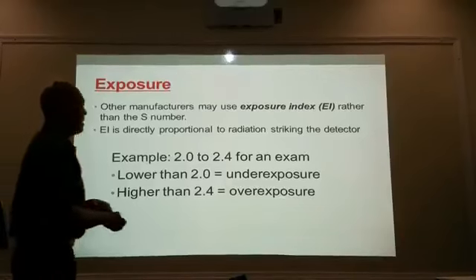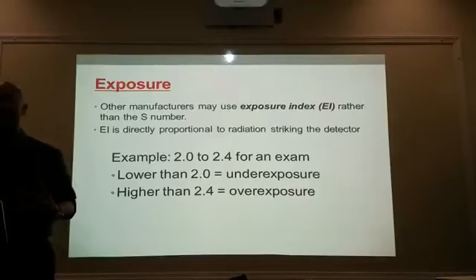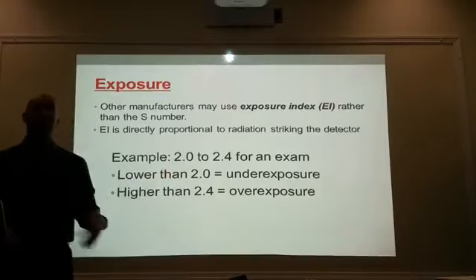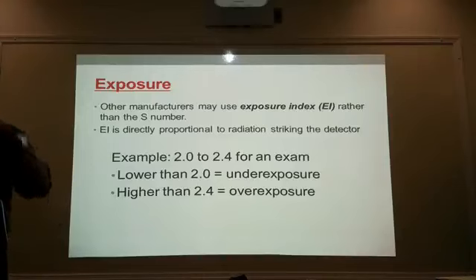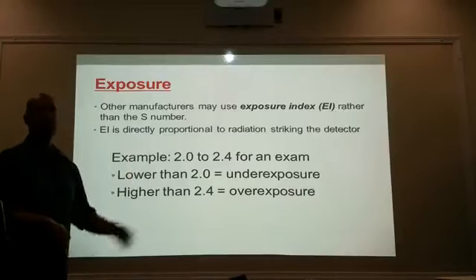Now, not only are these numbers good for patient exposure, but because a lot of the procedures that we are doing do involve us in the procedural room, if the patient is within safe limits, that means we are also under safe limits, because we keep track of our exposure by the amount of exposure our patients are receiving. So this is also good for us.